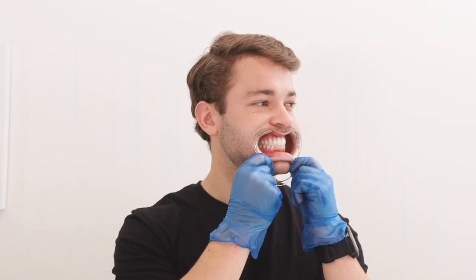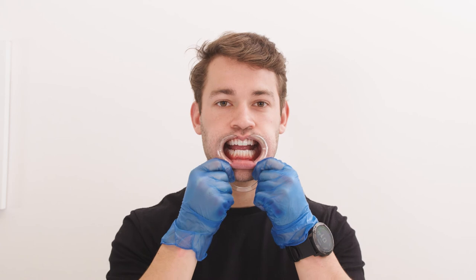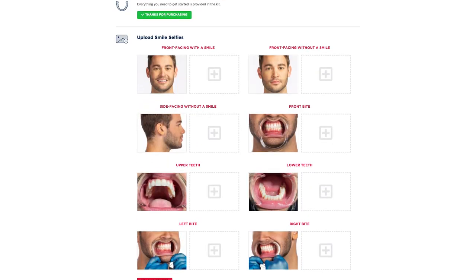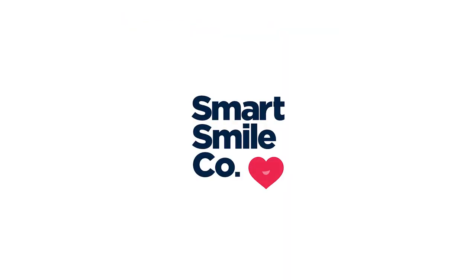Be sure to compare your photos to the photos in the guide. Don't hesitate to take them again to get them right — it's worth taking a little time so you won't have to resubmit. Now your photos are complete. Upload all eight photos to your SmartSmileCo portal and get ready to love your smile.